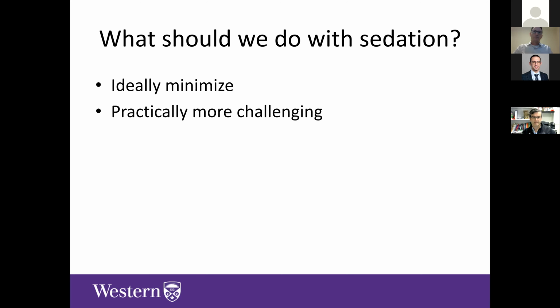Maybe getting a lot of eye rolls on that one, but I put in this statement, it's practically more challenging than that, and particularly in COVID. So we're not the only ones who are seeing that these COVID patients have huge drives to breathe and ventilator dyssynchrony, and a lot of difficulty in actually lifting sedation. There's a recent webinar from STS that had a lot of the large American centers talking, and this is the crux of where the challenge on these ECMO patients lies, is they struggle to wean sedation on them and get them up, but that is the ultimate goal, because there's so much benefit in doing that.